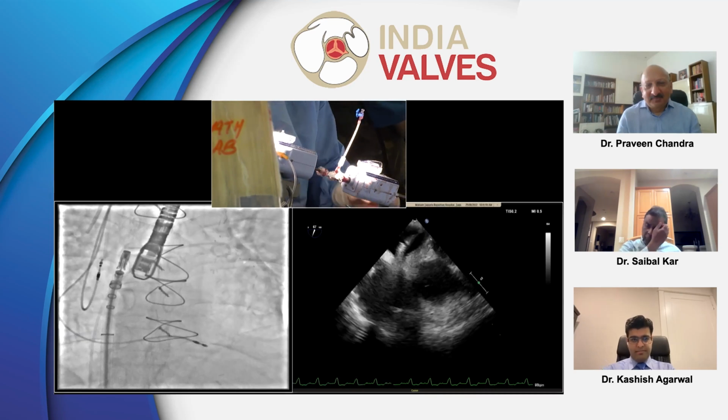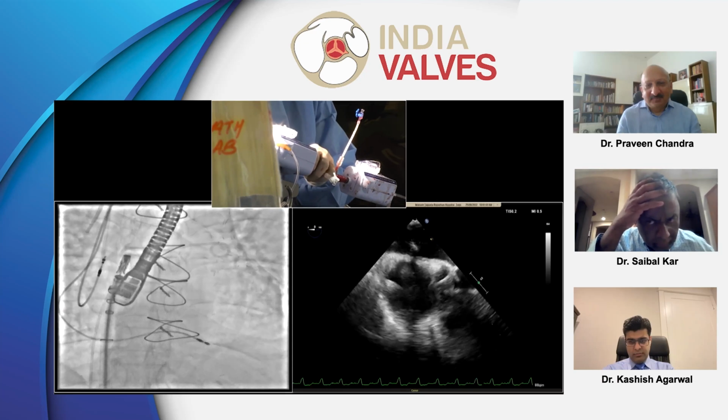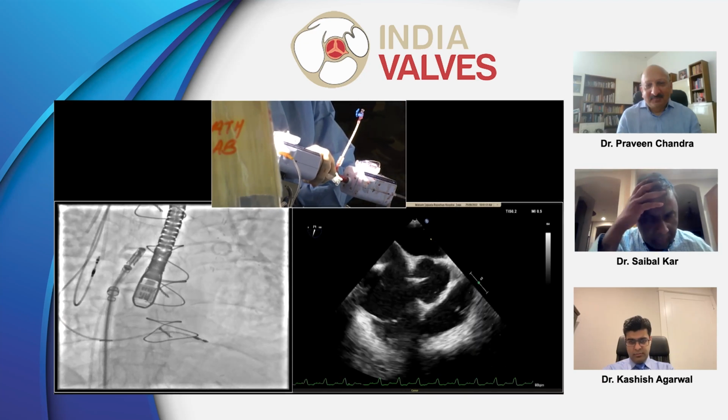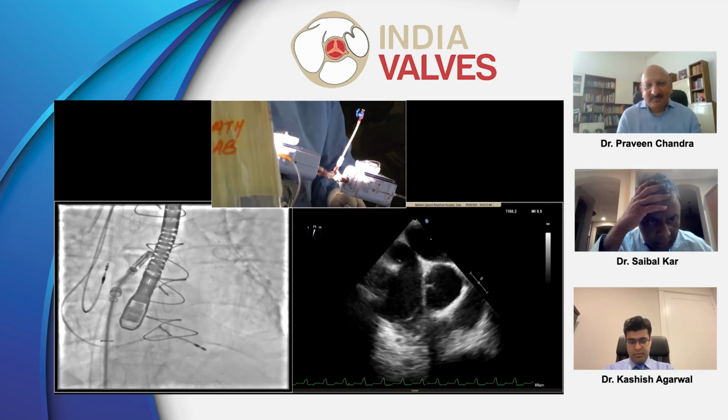Pull the guide back a little. Yeah. So I'm going to go ahead and advance more and try to straddle this. Yeah. Now just give M. Okay, so that's our straddling. We're going to give M here.